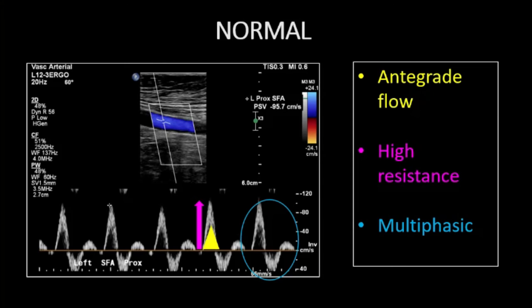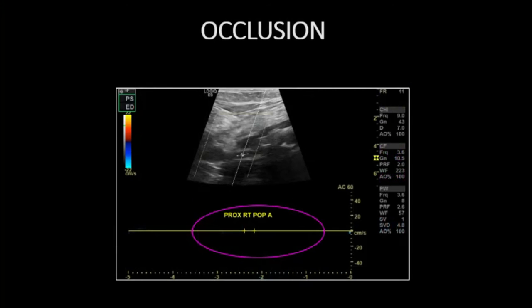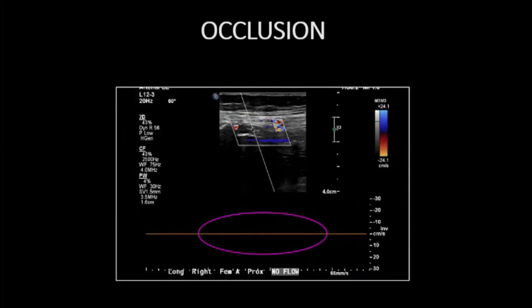To reinforce normal, again we see a multiphasic high resistance tracing with net antegrade flow and no evidence of turbulent flow to suggest stenosis. On the absolute opposite end of the disease spectrum, there's no arterial flow or spectral tracing in a case of arterial occlusion. On this color doppler, you can see color flow signal in the adjacent femoral vein, but there's no detectable flow in the SFA.